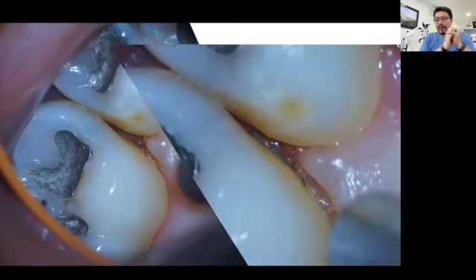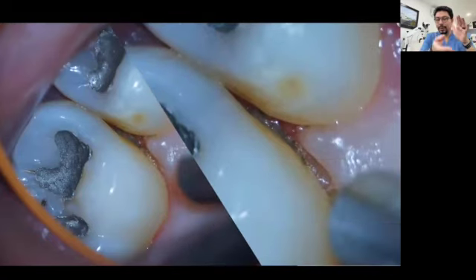Or you can have the possibility of taking one of those pictures, showing to the patient how bad it looks in the area. You can show to the patient the inflammation that is being generated in the area, and I'm 100% sure that all the patients will like to get it removed from in between the teeth, because it's not nice to see that. It looks disgusting, but the only chance of having this type of pictures is if you have the possibility of having these images in high magnification.